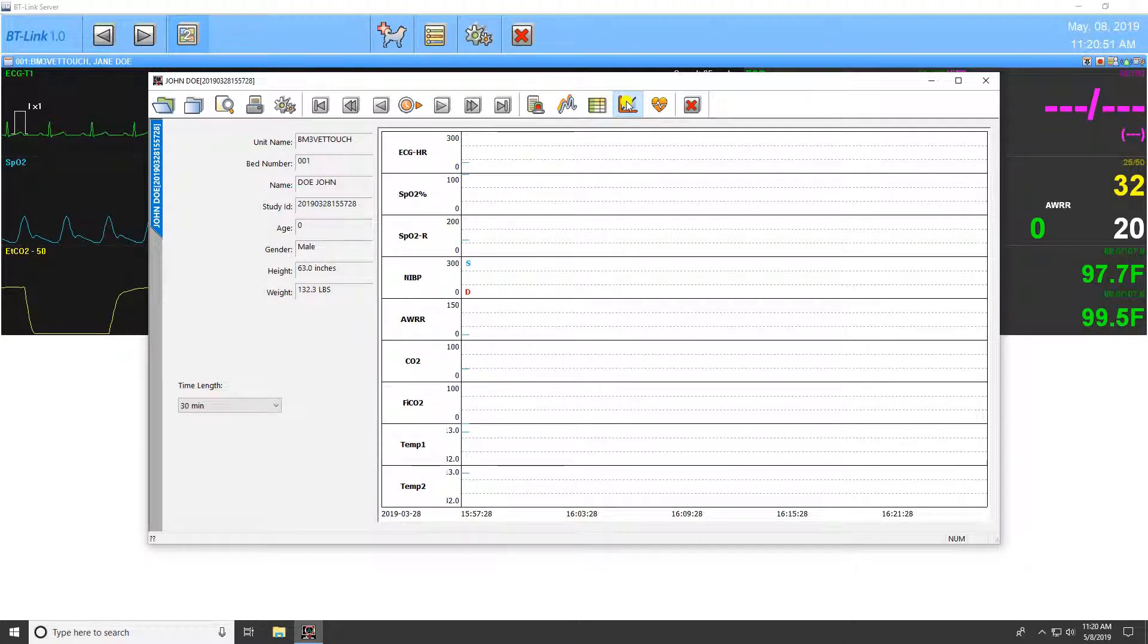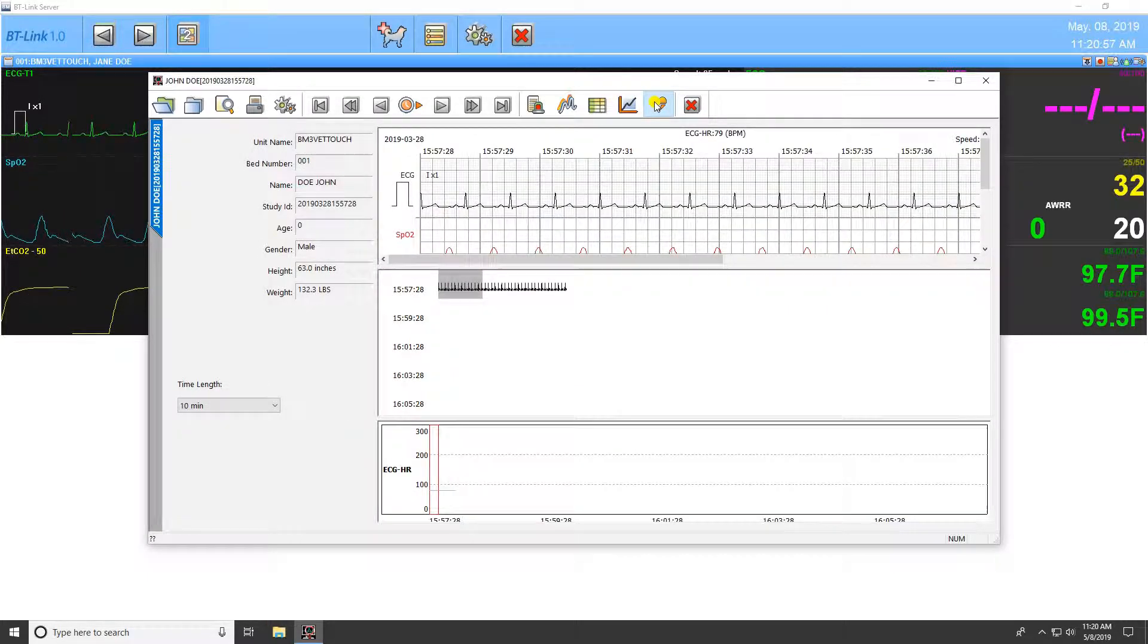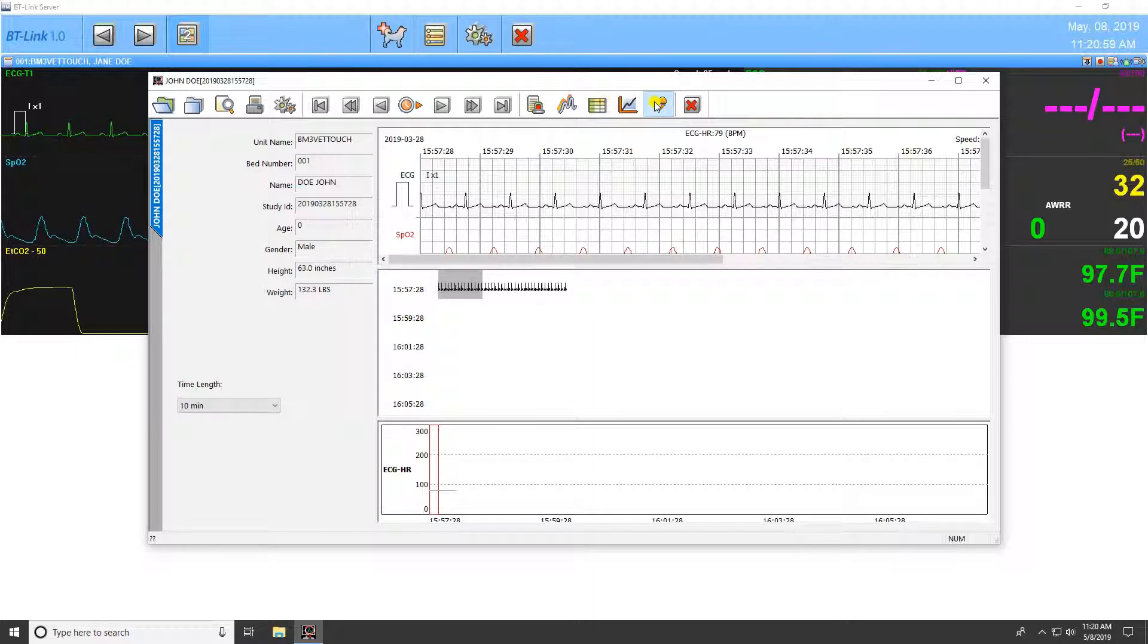Following this is the graphic trend view to display visual changes over time in patient data within the currently selected study. Finally, there is the ECG view to analyze the ECG waveform in particular.